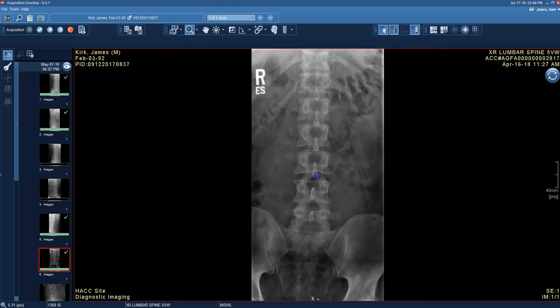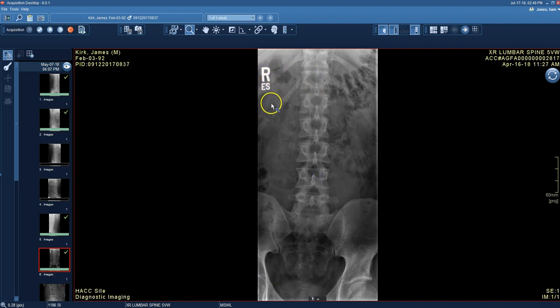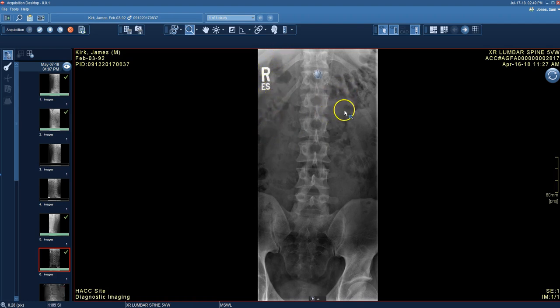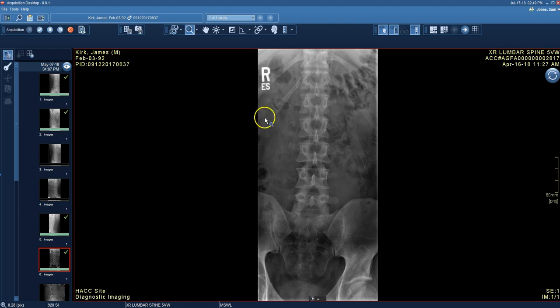That is window level, zoom, and pan — the three most important tools. Let me zoom back down a little. For those who don't know, that is a lead marker made of lead. The R tells me this is the right side of the body; the E and S are the technologist's initials. Without the marker I couldn't tell right from left or know if the patient was face down or on their back. So I know this is the right side and this is the left side — very important, for example, to identify that this shape is the left kidney and this shape is the right kidney.